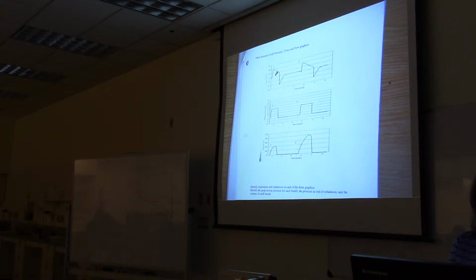I don't know if you have colored pencils or something with you, or if you just want to maybe draw the baseline really thick and then point to the top and label that inspiration, and then point to the bottom and label that exhalation. Got that labeled? Yes. Inspiration and exhalation?